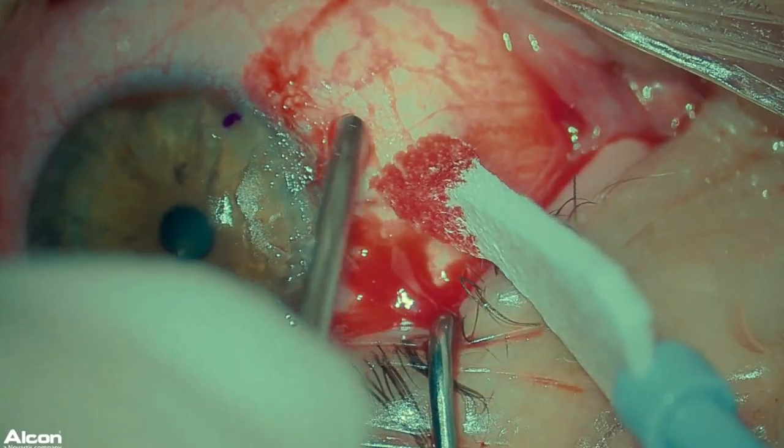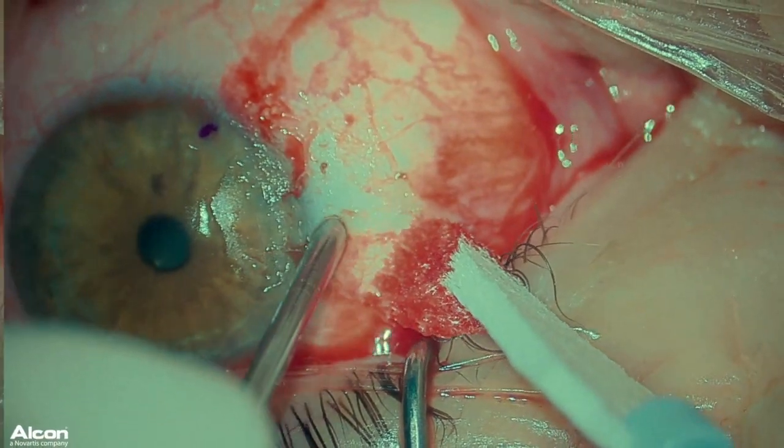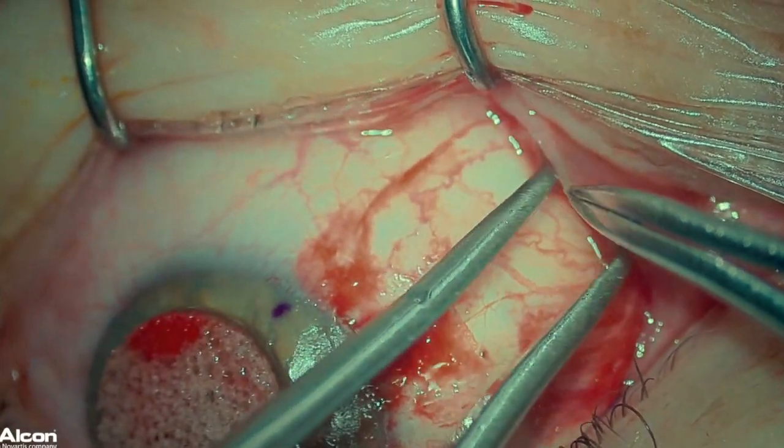If you have some persistent vessels that are bleeding, you can apply light cautery. However, do this only sparingly. Small amounts of thrombin in the patient's own blood will actually help the graft stay in place.